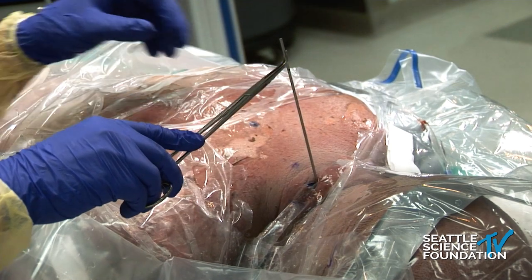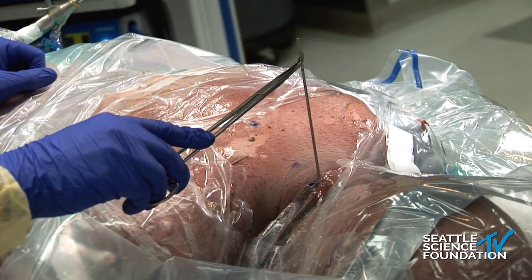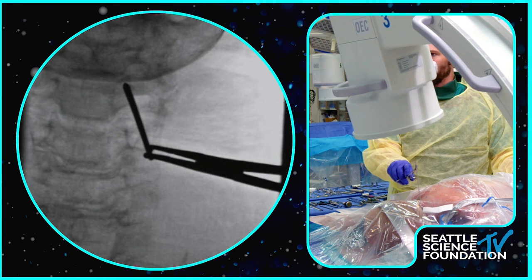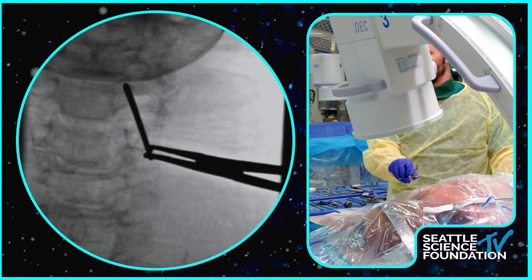Starting off with an AP here. What we're looking for is the little Y — the keyhole, whatever terminology you've heard — basically the joint, where it transits into joint from the lamina and the lateral mass. That's really going to be the target of your drilling, and that's where you want to center your fluoroscopic approach. That's a nice AP.